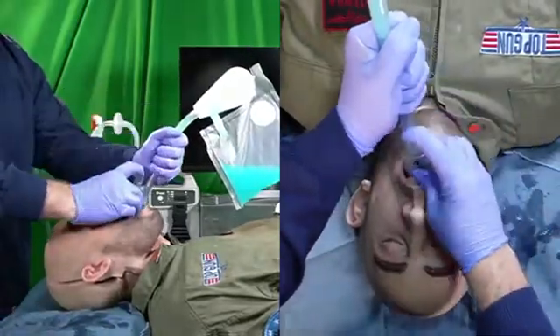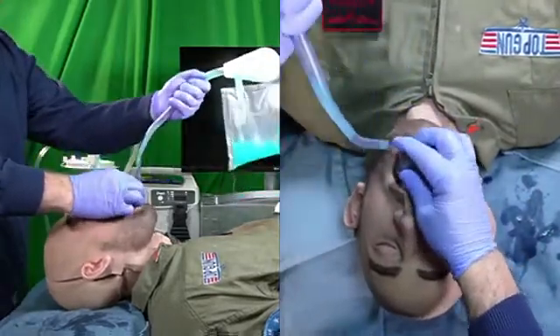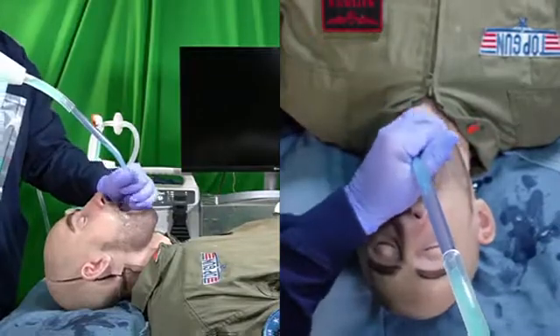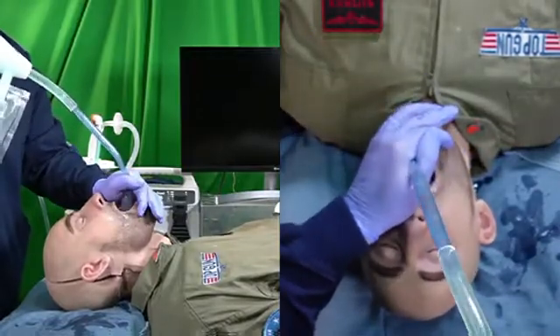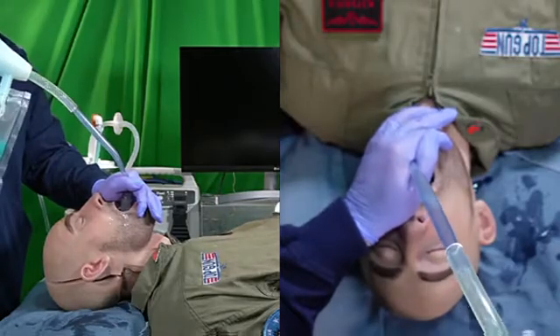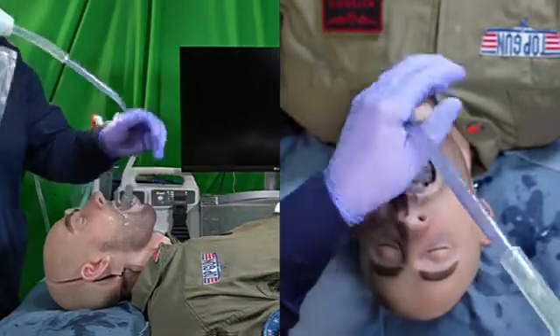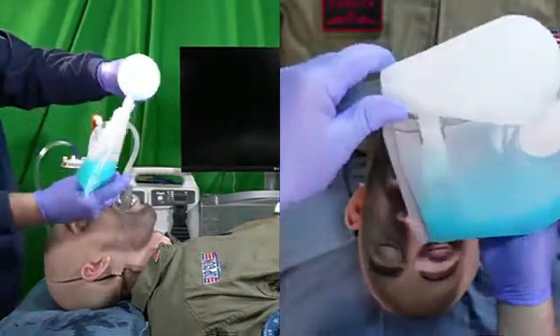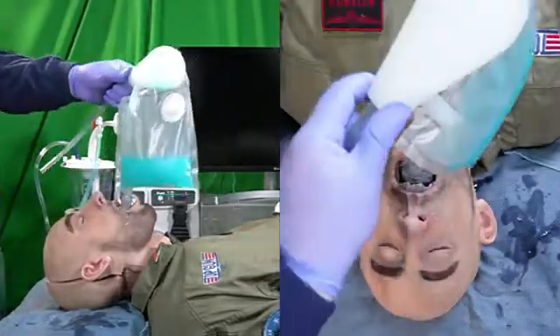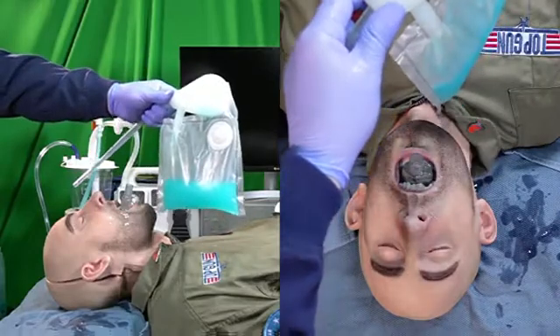I'll place the supraglottic airway fully into the patient and finish the insertion with the rapid airway decontamination maneuver. I'm able to thoroughly decontaminate. I have probably about 150 milliliters of airway contaminant here.